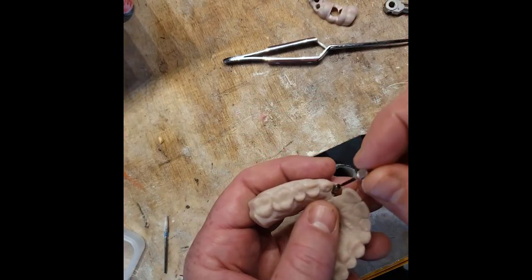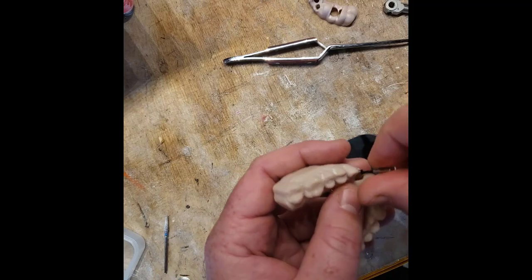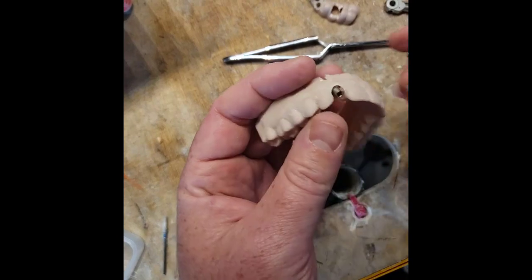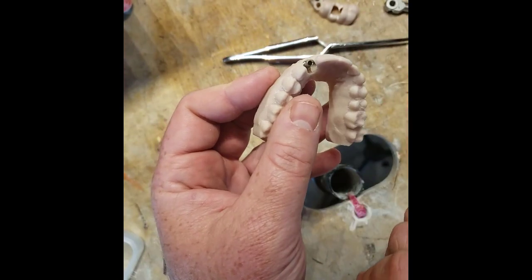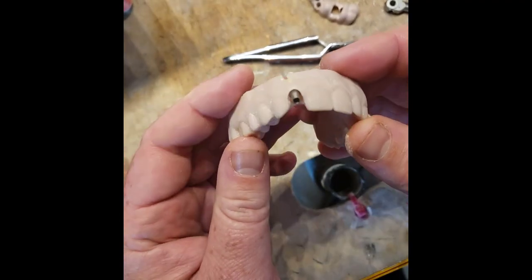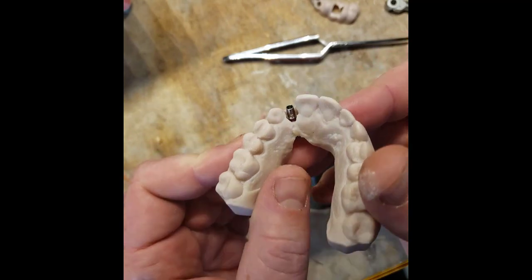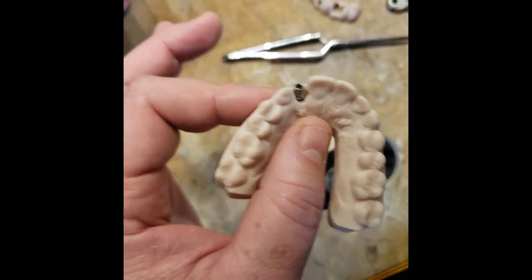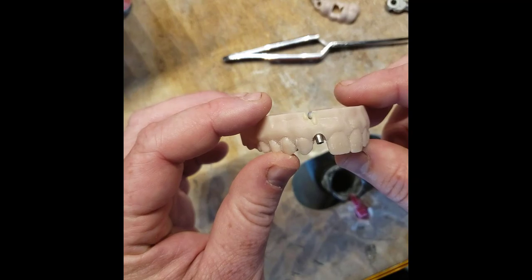This means that if you want to do an angled screw-channel restoration, you could have it made ahead of time — mill out your PMMA or emax crown and bond it ahead of time to your tie base. If you just follow those instructions when you deliver the implant with the guided driver, you'll know that your restoration is going to fit perfectly. And three to four months down the road when it's integrated, you'll be able to use this stock angled tie base and have everything lined up.